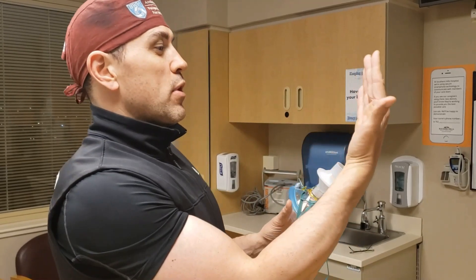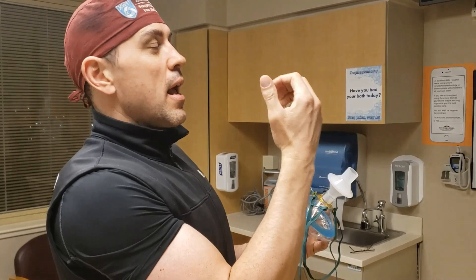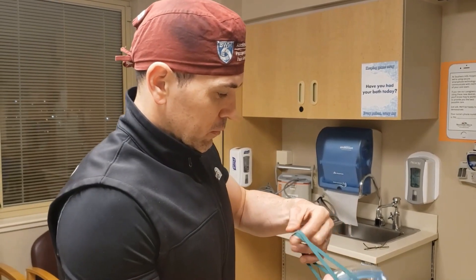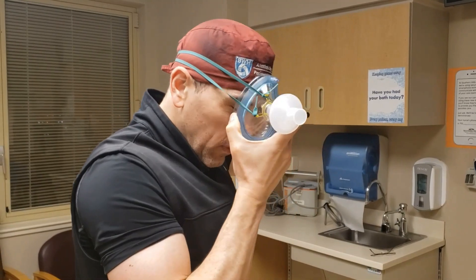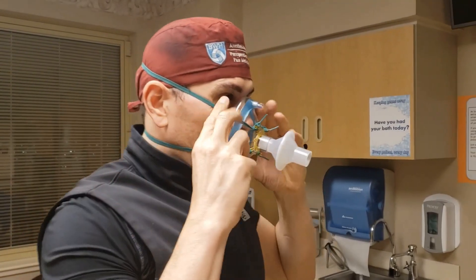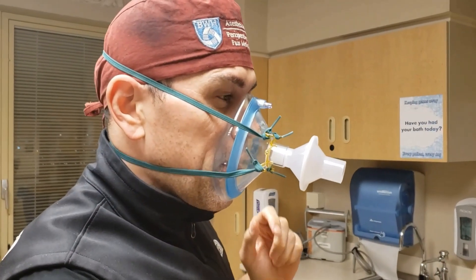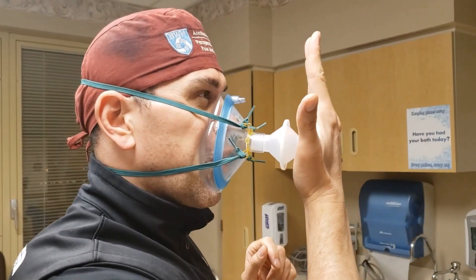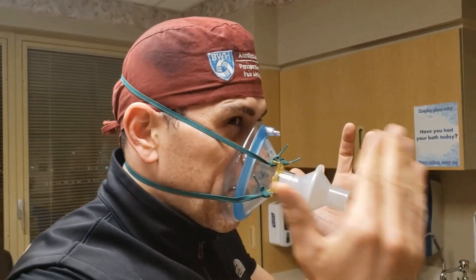Now I'm going to put the mask on and test it. I want to verify that when I breathe in, there's a seal and I cannot breathe in freely, and when I breathe out, I'm not losing air around the edges — that it's a tight enough fit. Breathing in — there was a seal and I could not breathe in. Breathing out — there was a seal and I could not breathe out.